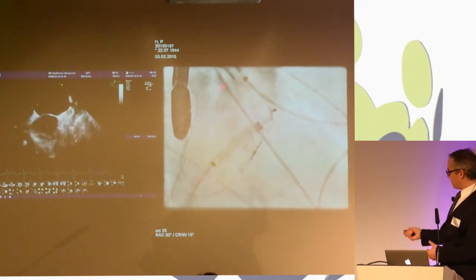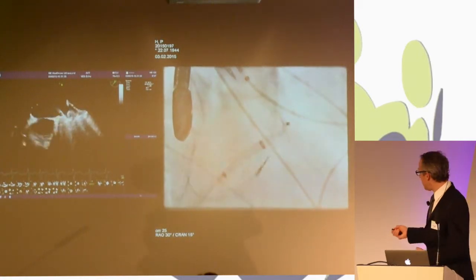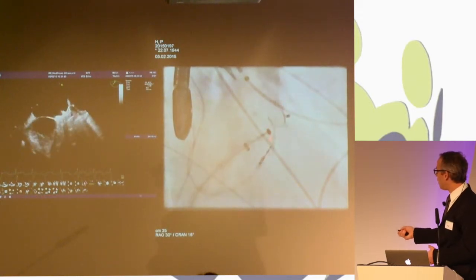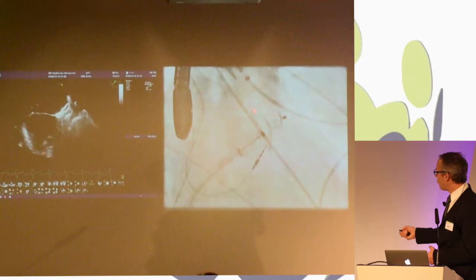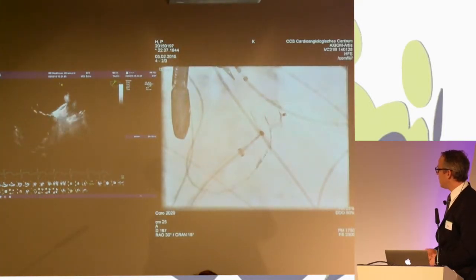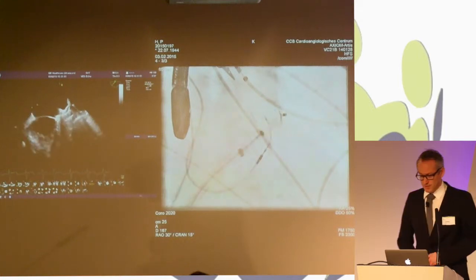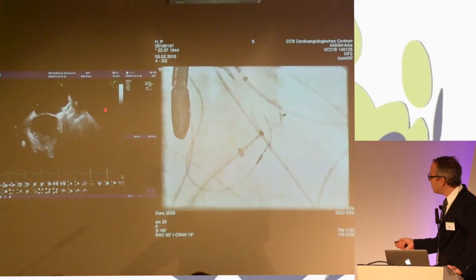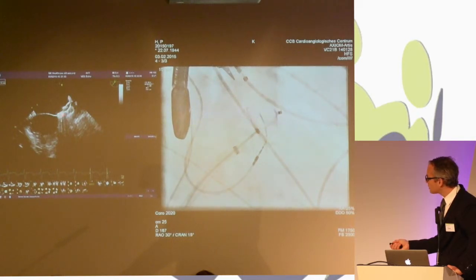Okay, completely different shape now. I will explain this shape to you in a minute. A lot of compression on the lobe, and no real separation of disc and lobe in this first image. Well, we look at echo. At echo, the position is definitely a little more distal here. More than 2/3, almost the complete system, is behind the circumflex artery.